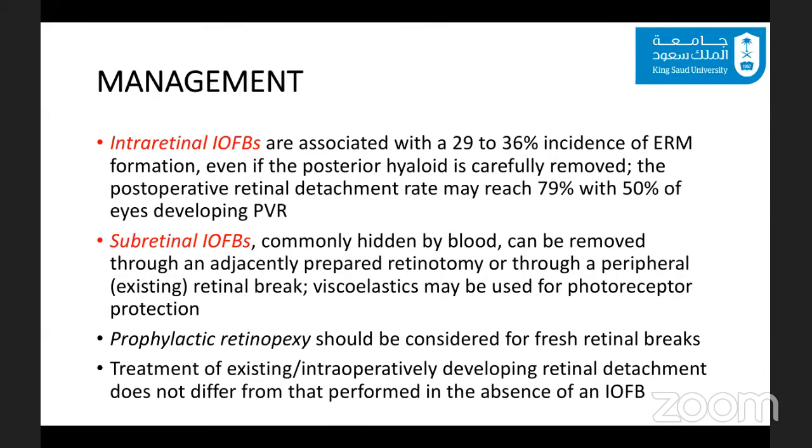For intraretinal foreign bodies, there is a higher risk of PVR and epiretinal membrane formation. And for subretinal intraocular foreign bodies, usually they are hidden by blood. And in such cases, sometimes you might consider that the removal might not be of benefit, especially when you do an ERG.